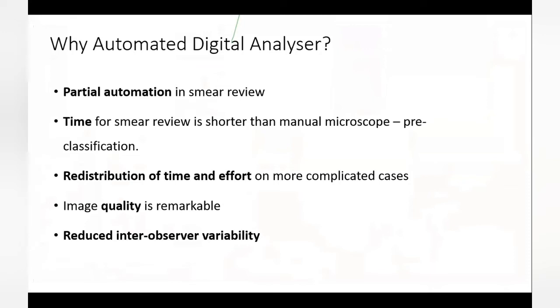One is we have seen how we can bring in a partial automation in smear review. And what it does to us is it saves us a lot of time for review of smear. And it also helps us use the saved time and effort in more complicated cases. Like Sir was saying, I think a lab has many more challenging things going on where you can redistribute your bandwidth and your effort. And also the image quality is remarkable.